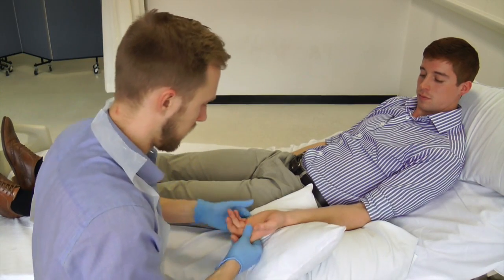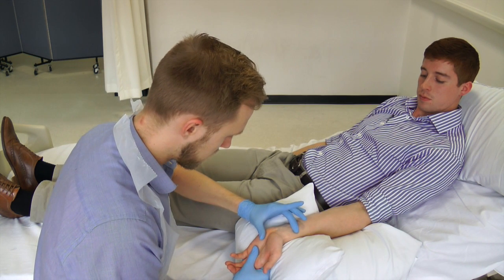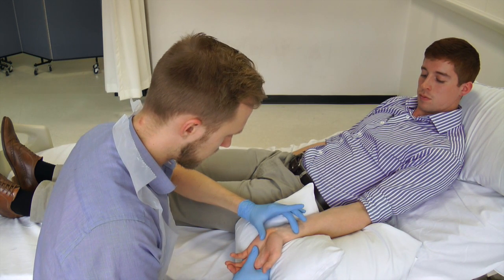Gain informed consent and explain the procedure. Position the patient comfortably with their wrist on a pillow, extended gently.